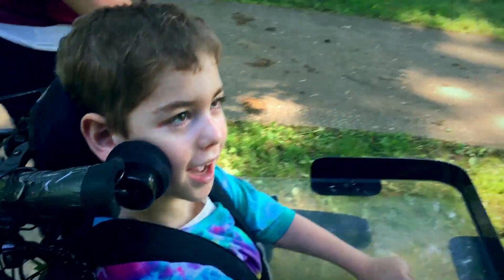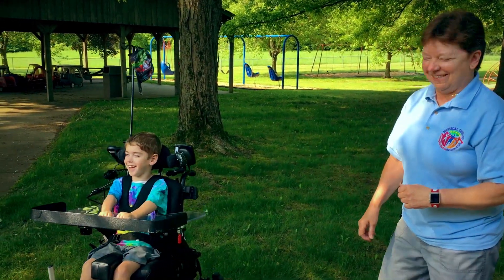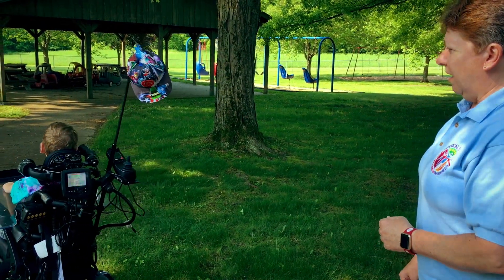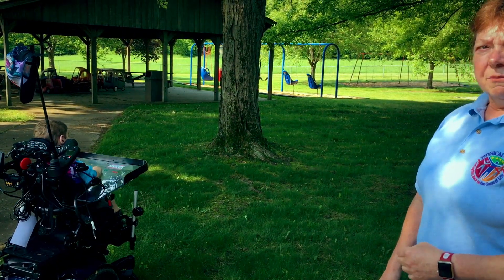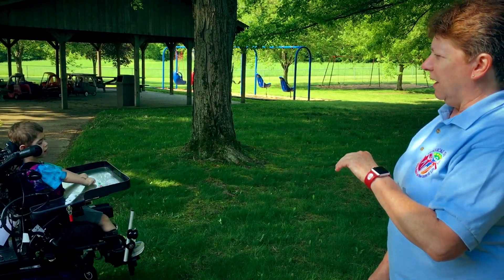His head tends to go to the right, so with the headpads in place he likes to do circles. But that's why we found that working first on just driving forward was a good way for him to learn. And he's working on his head control — his head control has actually gotten better since he's had the chair, because he has to work on that purposefully, lifting his head a little bit.